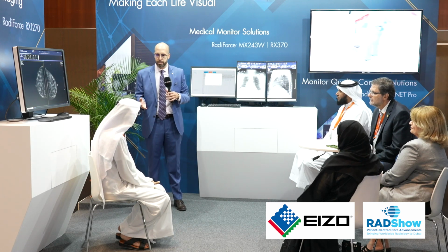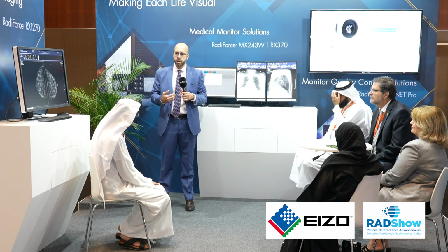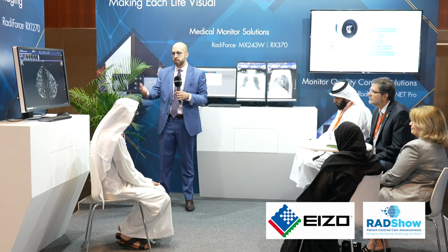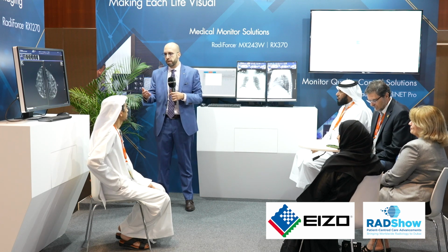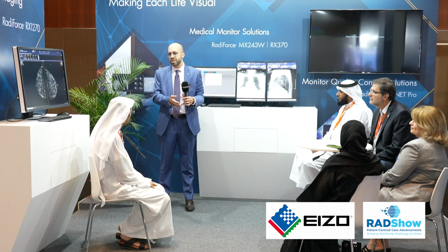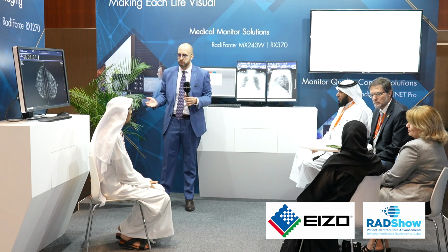We do the calibration for the clients that have the old monitors, either they are doing the calibration or they tell us to do it, and we see that some monitors do not pass the calibration. So we do another test. If they don't pass, then we recommend changing the monitor, or we take it to repair, which is not logical, because the cost of buying a new monitor with a 5 year warranty is better than repairing an out of warranty monitor.